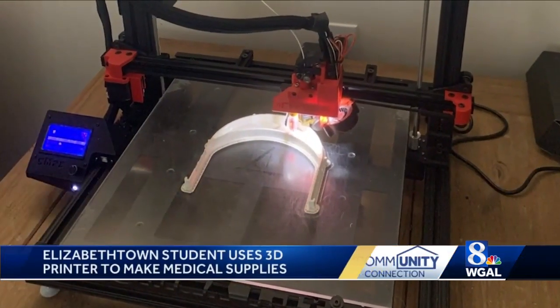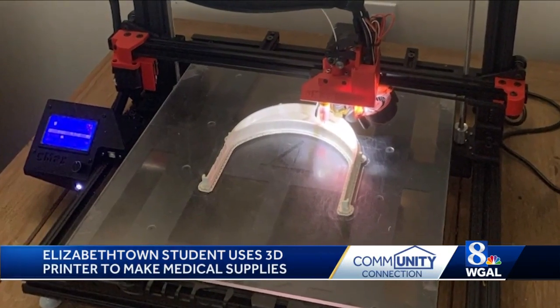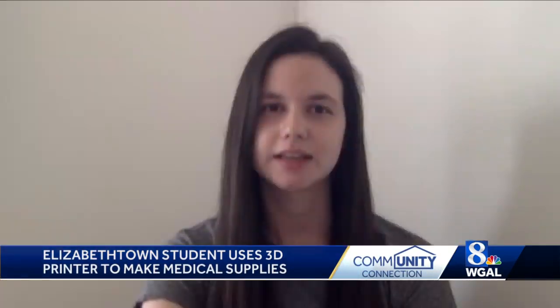I'm making the headband portions for the face shields. I've been sending the headbands to Drexel University and they've been putting the face shields together and distributing them to different hospitals in Philadelphia. I've also made 20 face shields for a dental practice in Elizabethtown.